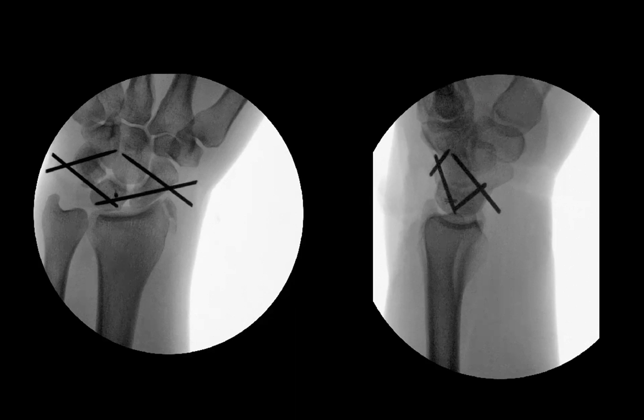So I guess, does the attending think there was anything attached to the radial styloid? We felt that it was pretty well reduced. I know it's reduced. I'm just wondering why normally we put a pin in the radial styloid. Maybe he thought there was nothing attached to it. You can pin everything else. And if the radial styloid displaces, if there's anything really attached to it, you're not going to end up with what you see right now.